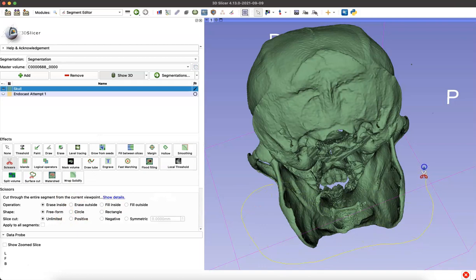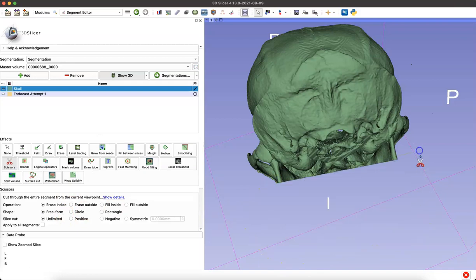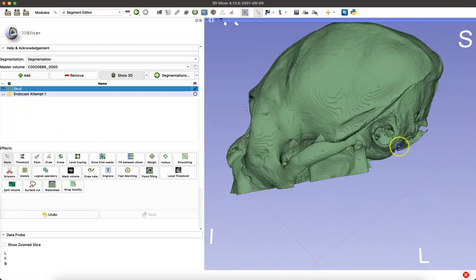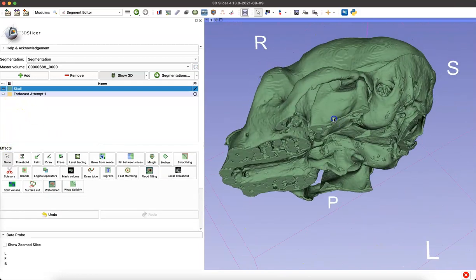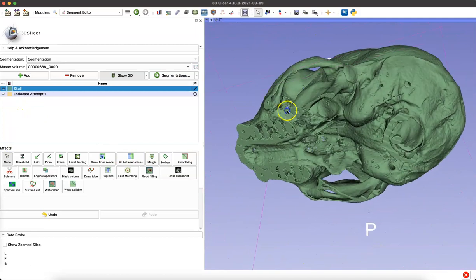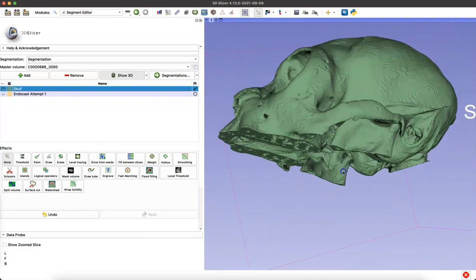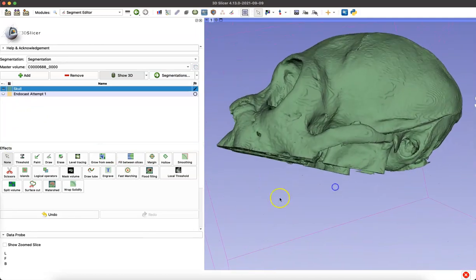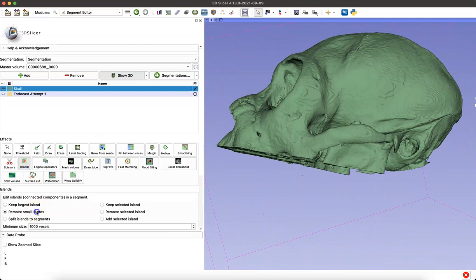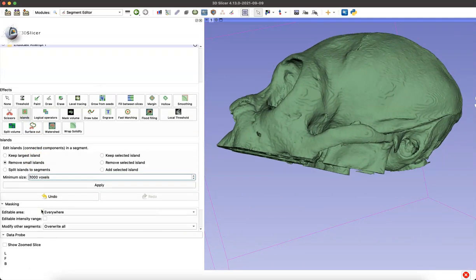Basically what we're going to try to do with all this segmentation, where here I'll try and take away the mandible, everything up to the cranial base, is I'm trying to isolate the neurocranium, the vault, so that we are helping the program out as much as possible by erasing all this unnecessary information that we don't need in this model anyway.